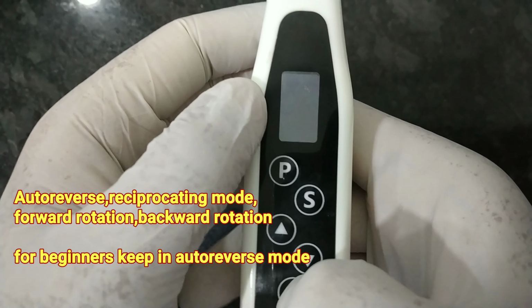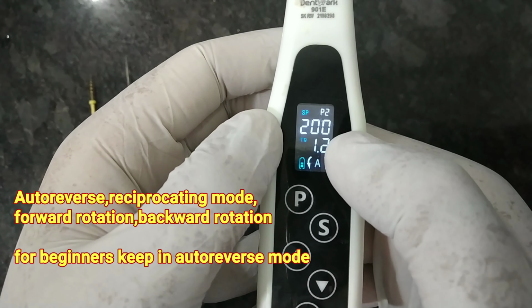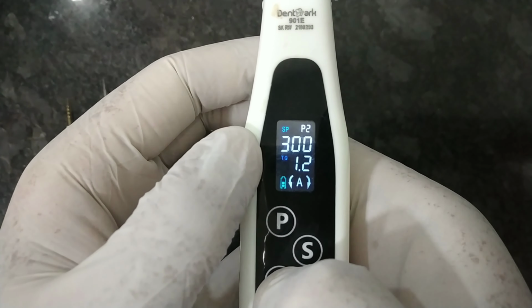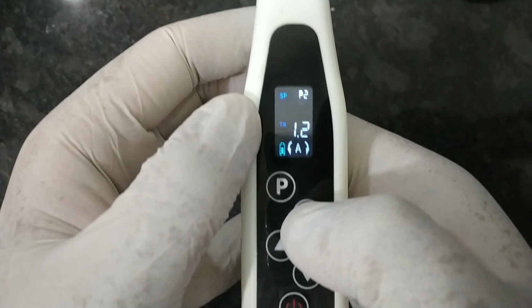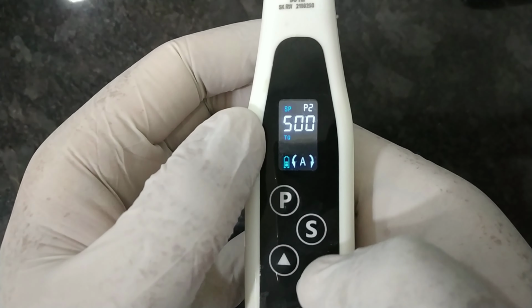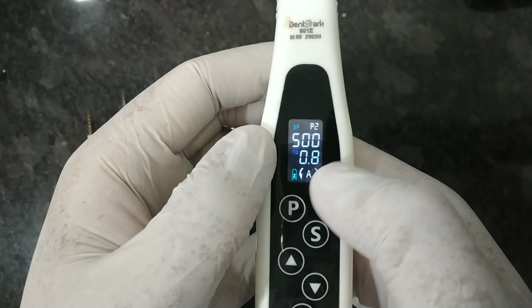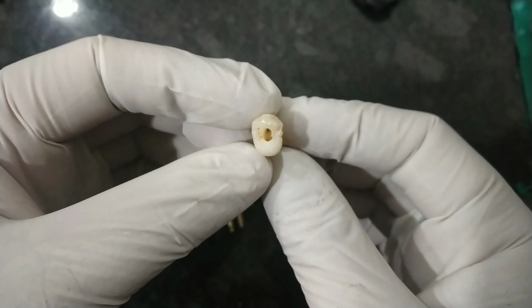Suppose again I want to set it. P2, I want to change to 500 RPM and 2 torque. So what I have to do is, again I have to press S, then I have to increase it to 500. Then again we have to press the S, then we have to increase the torque or decrease the torque. So it's very easy, and usually I tell my beginner students to just use the auto reverse mode instead of any other mode, because that is the easiest mode to use. So this is the maxillary first premolar tooth.